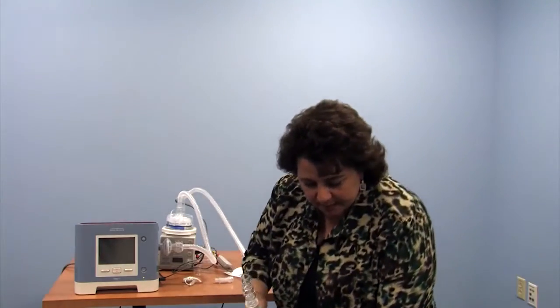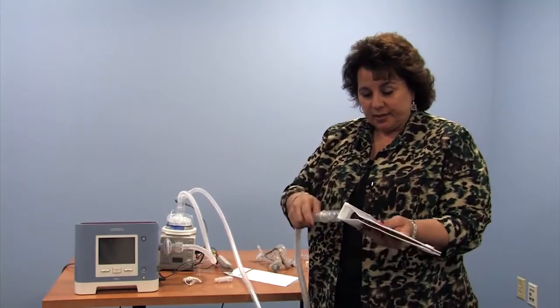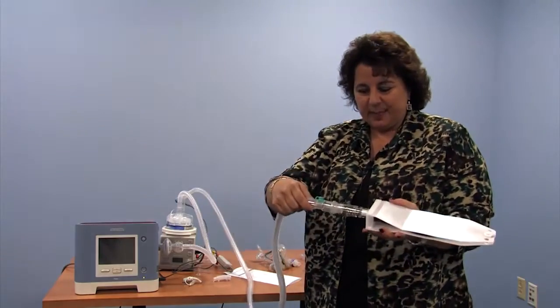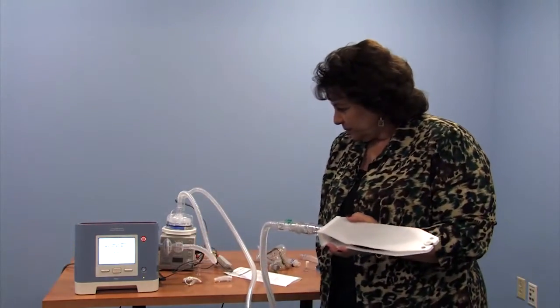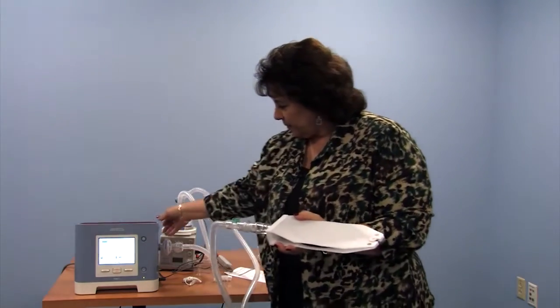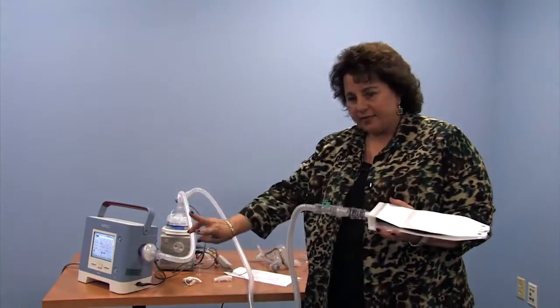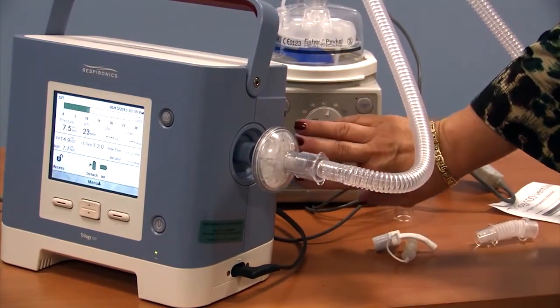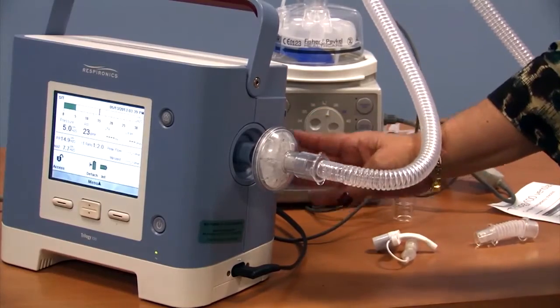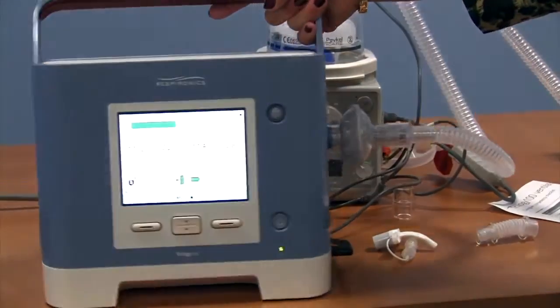I'm going to hook up our now passive pediatric circuit to our test patient, and we will turn our machine on and see what that looks like. So one thing you'll notice is we no longer have the two lines hooking up to the active points in the rear of the machine here. Those will be missing if your child is on a passive circuit.